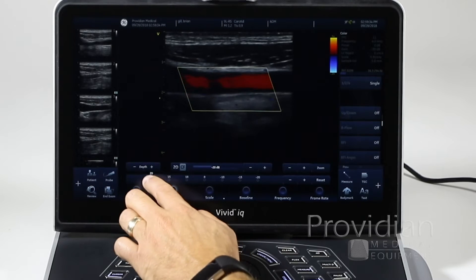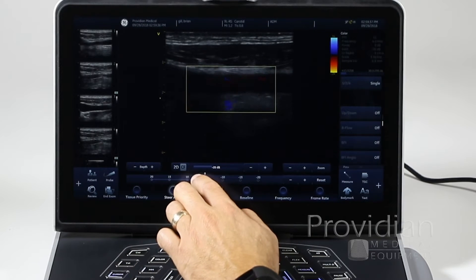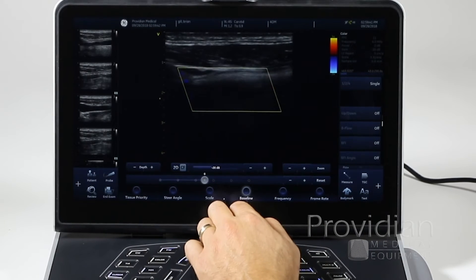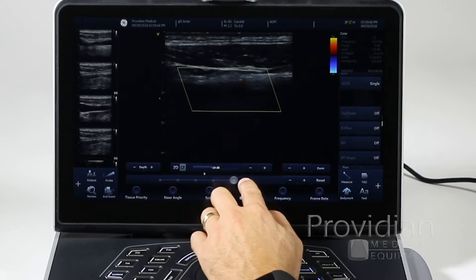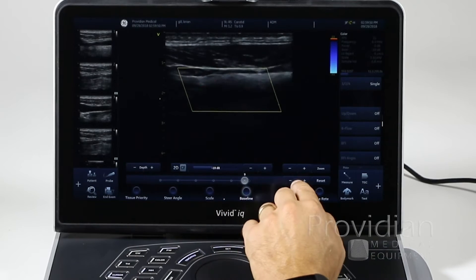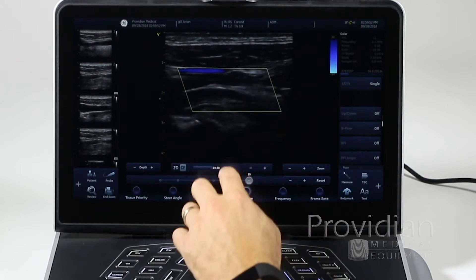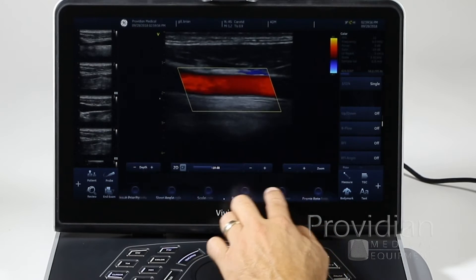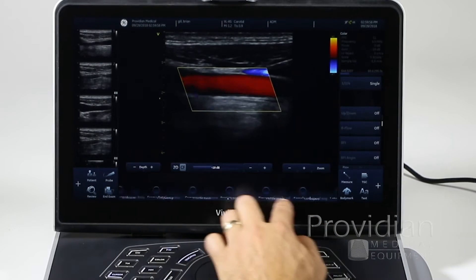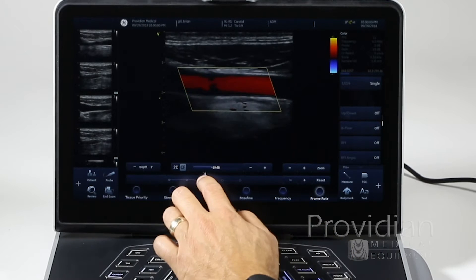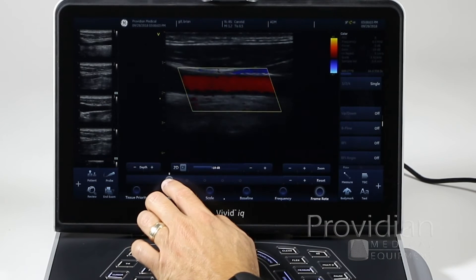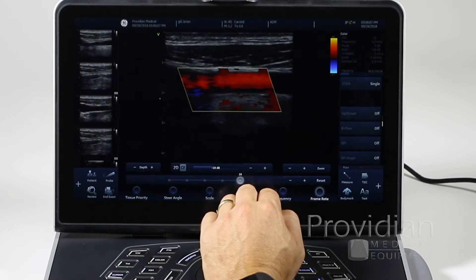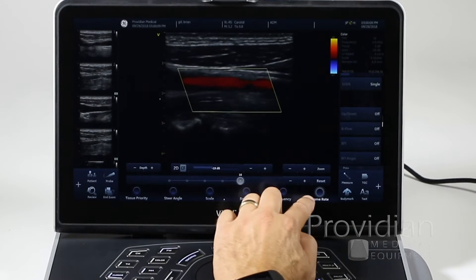Where do you want it to focus its processing? Steer angle — multiple angles here. Scale changes your color scale. Baseline — sliding or hitting the plus or minus — you'll see that the color map changes based on the baseline. Frequency. Frame rate: if you move the frame rate down, you'll get lower frame rate, which gives you higher resolution. High frame rate gives you lower resolution but a higher frame rate.